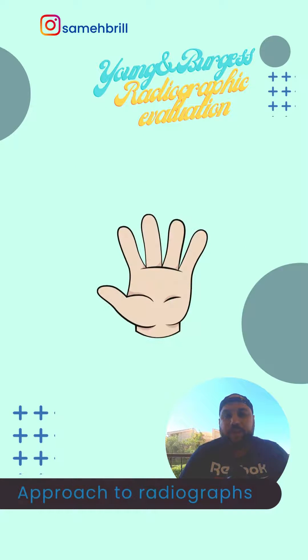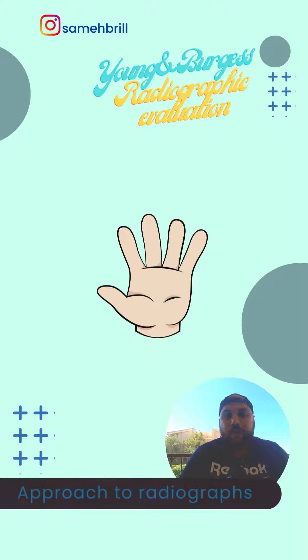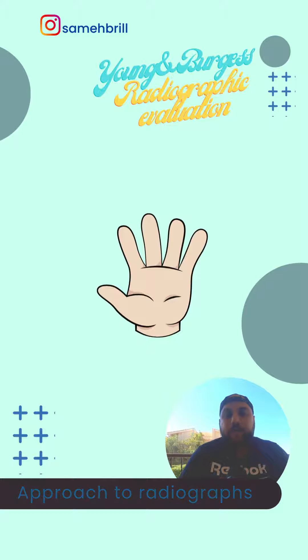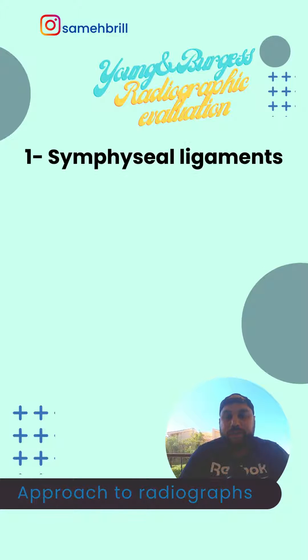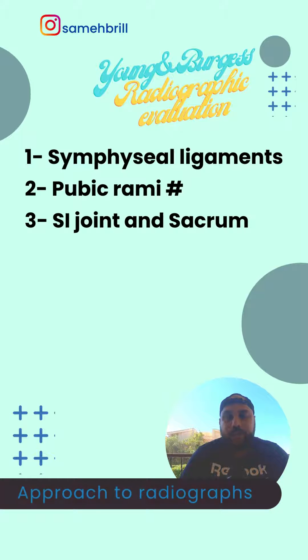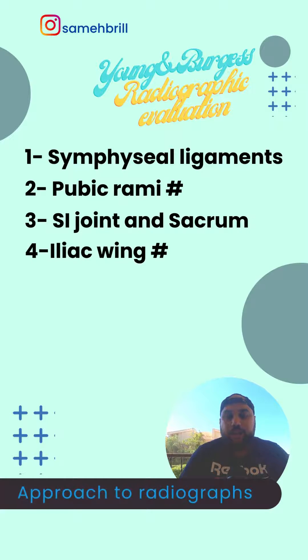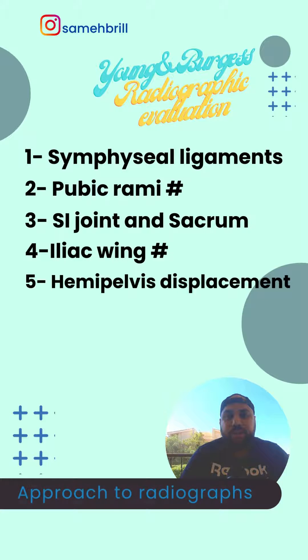I have five major points to keep in mind in order not to miss any fractures on the x-rays. Number one, I'll go for the symphysial ligaments, then the pubic rami, then the sacroiliac joint and the sacrum to see if there is any disruption or sacral fractures present. Then I'll go to the iliac wing, and finally the hemipelvis to see if there is any displacement.